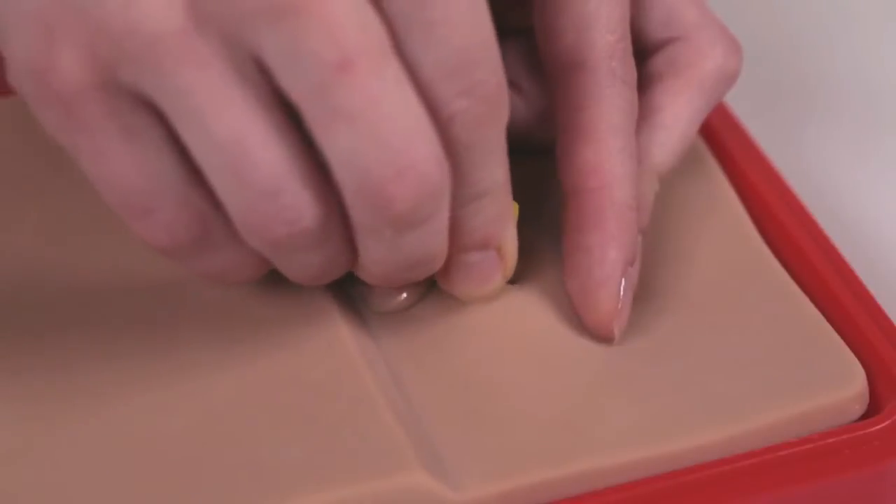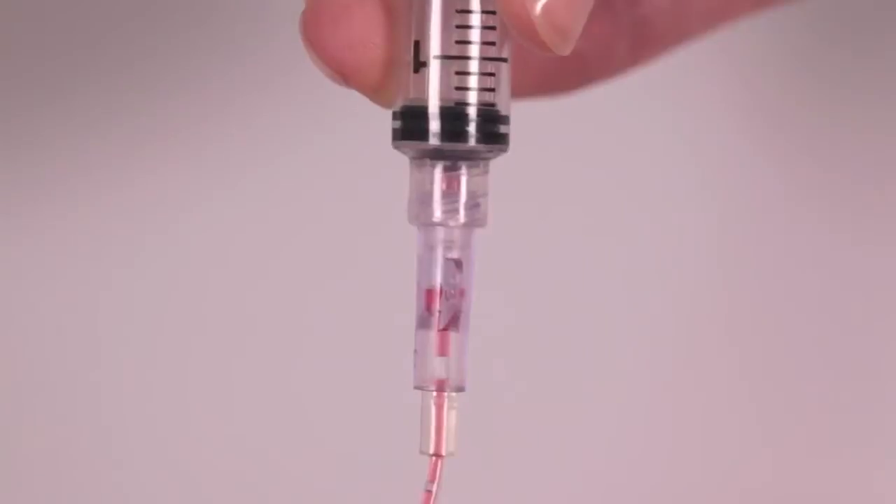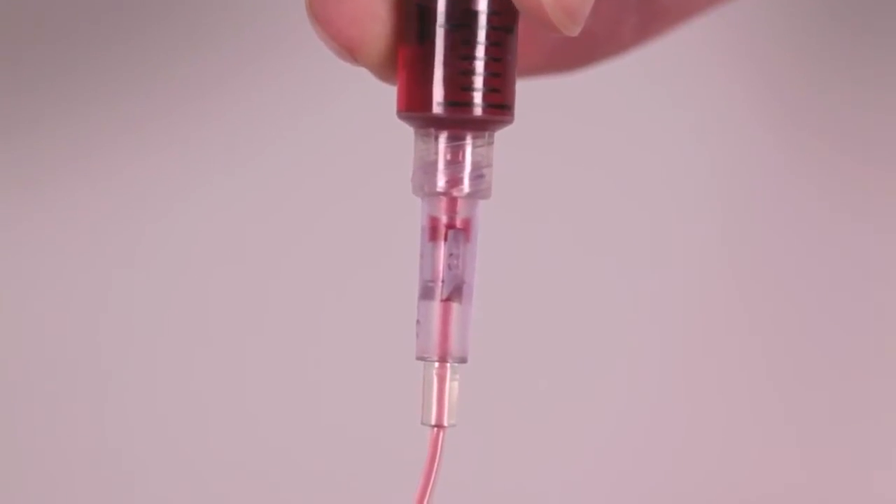The supplied right angle Huber needle is used to access the port, and successful access is confirmed by observing a blood return when pulling back on the syringe.